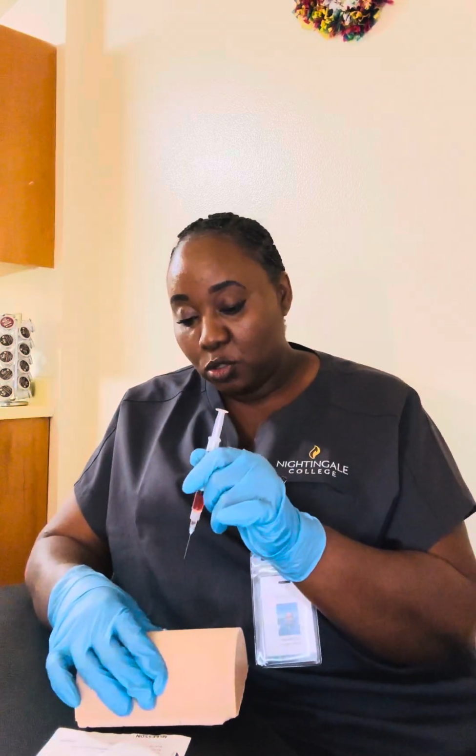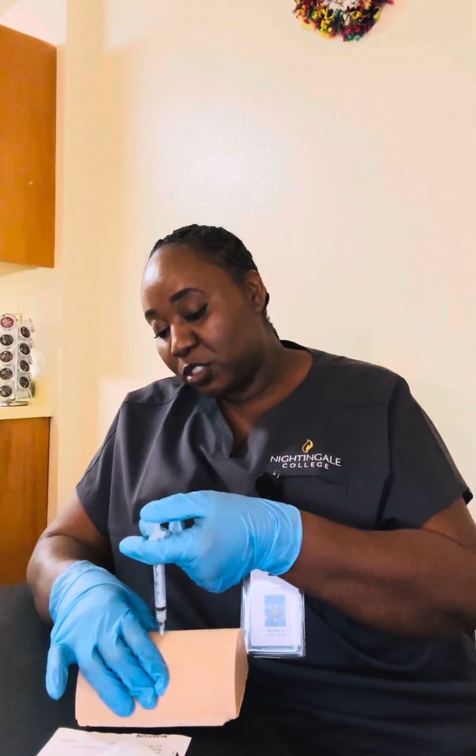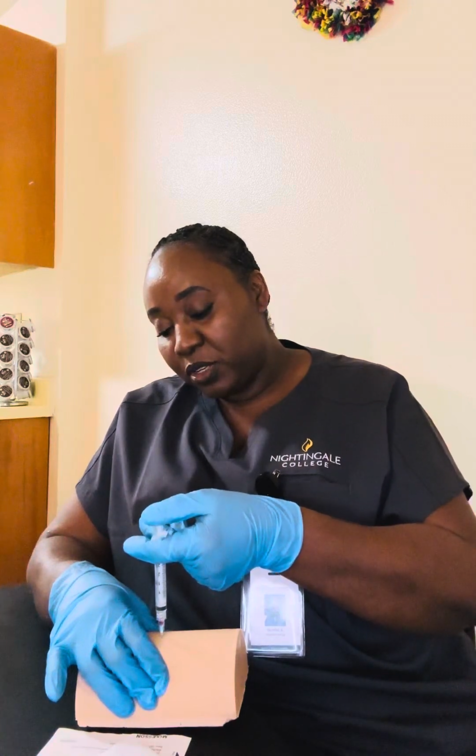So for the administration, I'm going to pinch the skin, use my dominant hand and go in straight, gently but quickly, going straight. With my non-dominant hand, I'm going to hold still while pinching. Preferably heparin medication should be administered slowly while it's being pinched, and then I'm going to administer that slowly over 30 seconds. If it's a safety needle, it will snap, but this is not a safety needle.